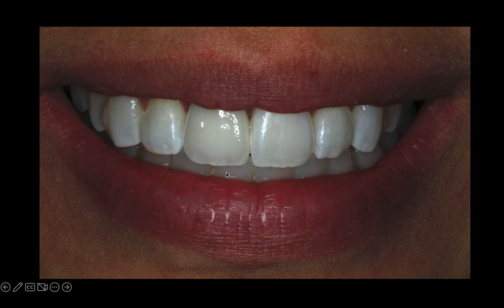Of course, this is layered and it has characterization. You can see the white opacity on the edges, the white halo. You see the translucency. You see the mamelons down here. And it looks pretty similar to this one. Of course, over time it looks even better because the glaze went away. This is kind of too shiny for her own teeth. And she was a nurse. She was very busy. She never came for cleanings or stuff like that.